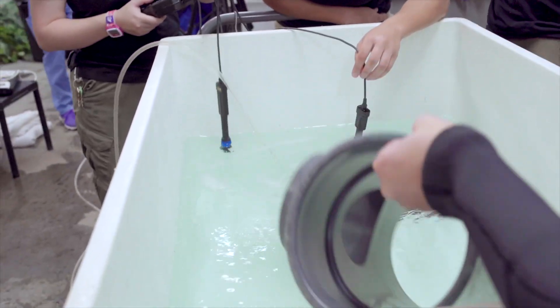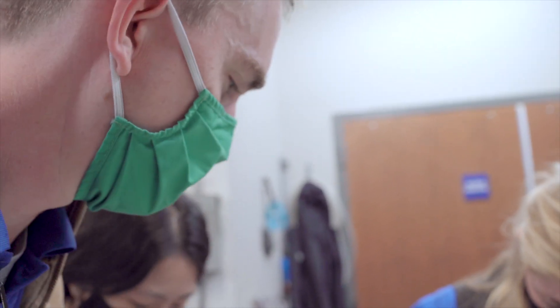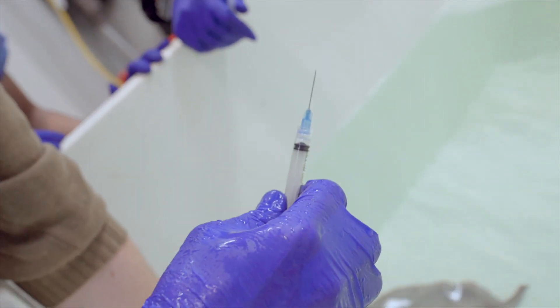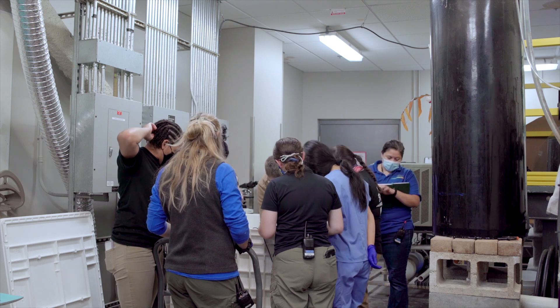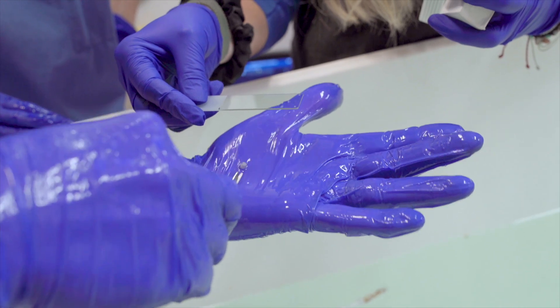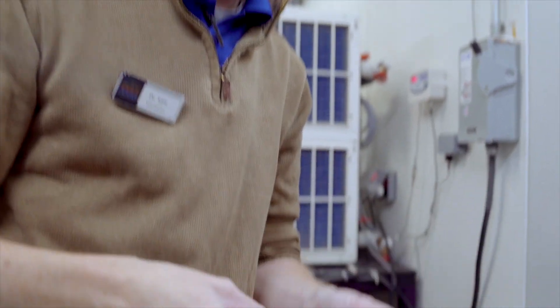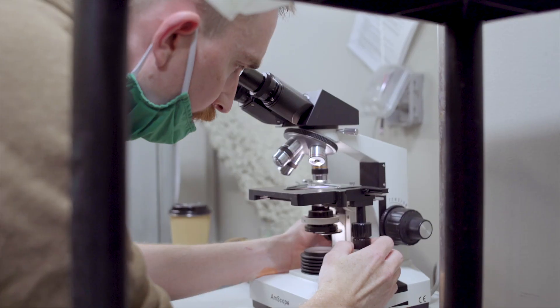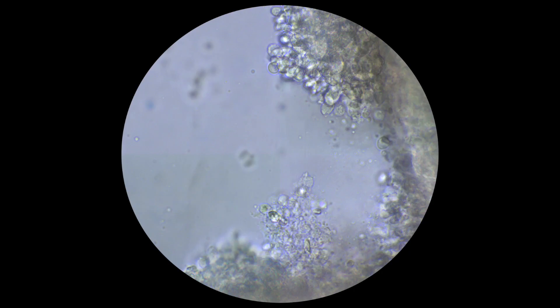After about 10 minutes for the anesthetic to take effect, we went ahead and started collecting some diagnostic samples. The first of which was a hemolymph sample, collected from a central vessel within one of the arms — you could pick any arm, it doesn't matter. We'll look at this smeared out on a slide and assess the different cell populations. Additionally, we got a gill biopsy. We exteriorize the gill filaments and then with a really tiny sharp pair of scissors, I remove a tiny fragment from the gill and look at that under the microscope. In this case, we were able to see some relatively common gill parasites we see on octopuses — Ichthyobodo.